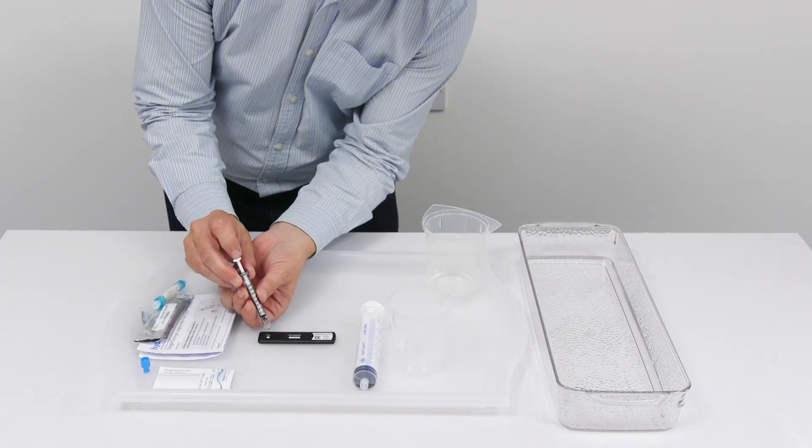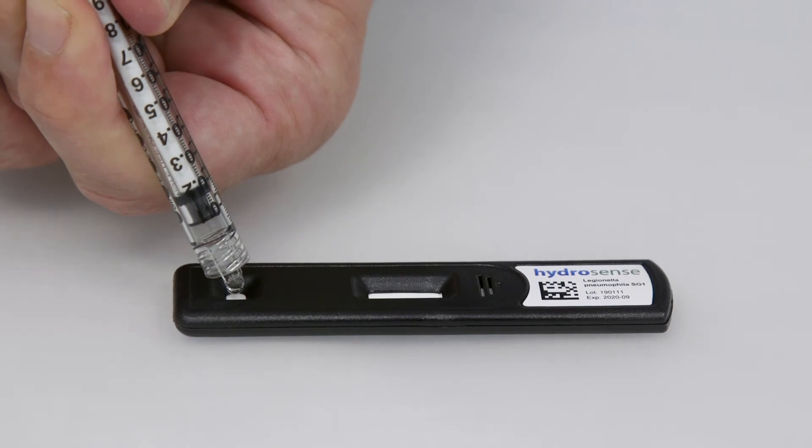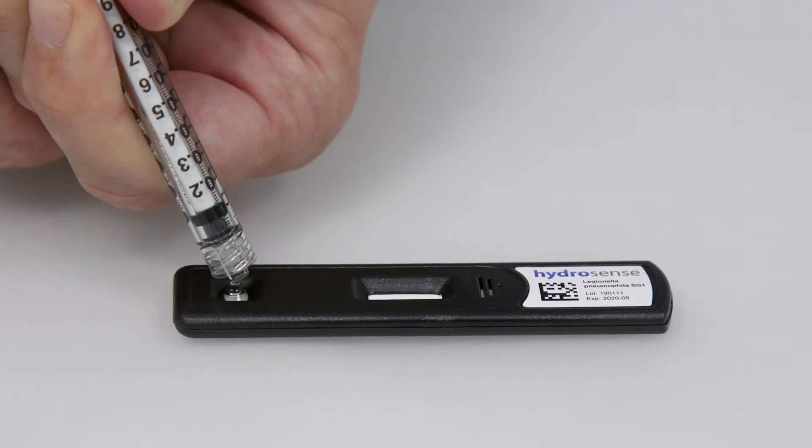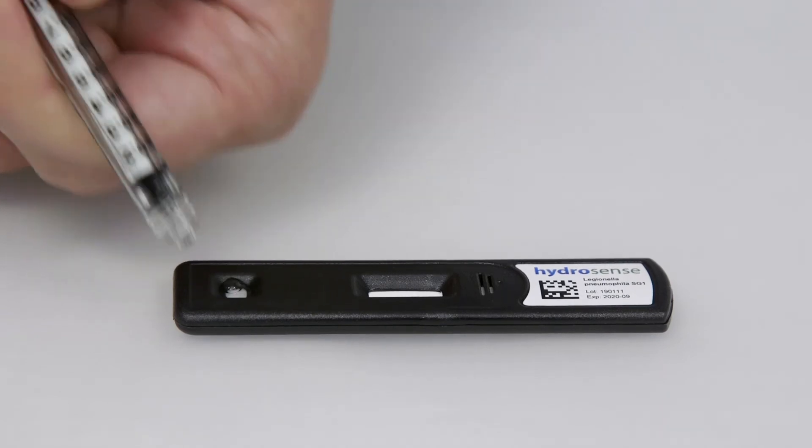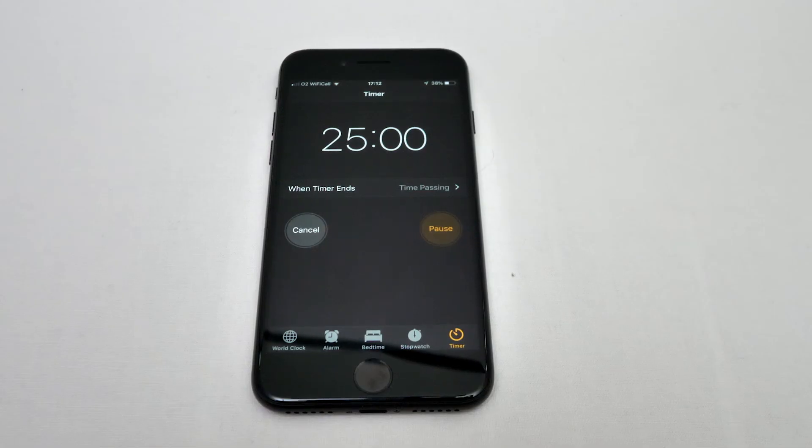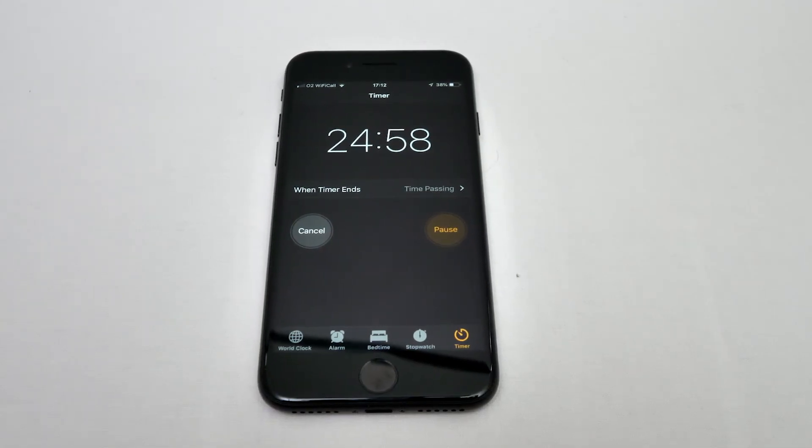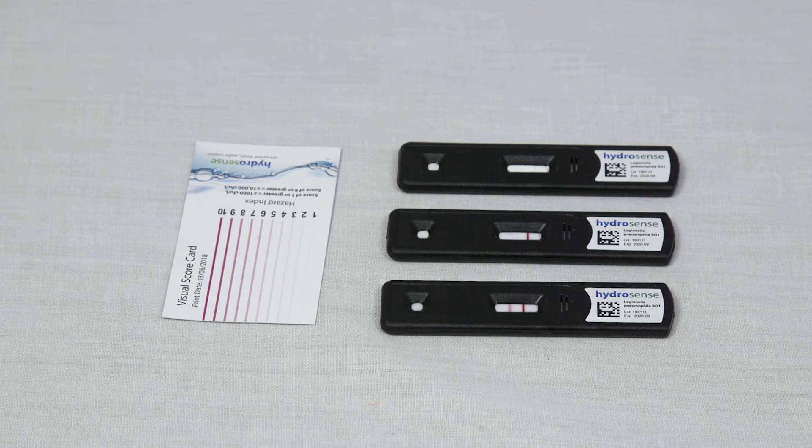Then in an upright position, depress the plunger onto the sample port of the test, dispelling all of the sample. At this point we would start a timer for 25 minutes and then read the test after 25 minutes and no longer than 30 minutes. If the test is read before 25 minutes or after 30 minutes, then you may get inaccurate results.